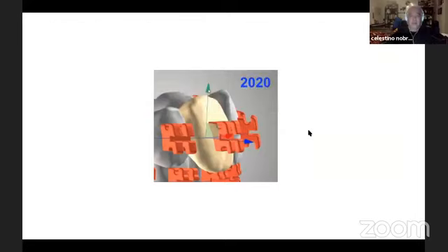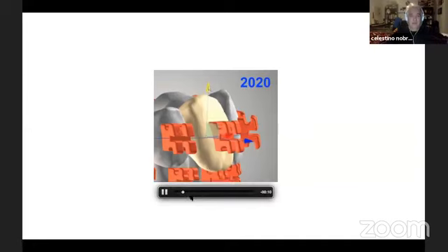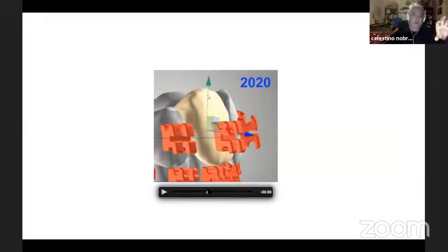This is 2020, okay? And now we have this possibility here. I remember Dr. Friedhaus and Dr. Kathy and Ari, we talked about this 1 year ago, and now this is reality. This is the point. We can prepare a setup like for an aligner. I'm going to show you the platform. It's the same we do for an aligner.